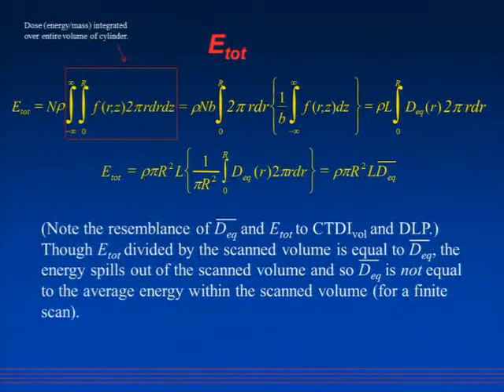What this amounts to is, if you do this uniformly and so forth, you can easily show this is equal to the length of the scan, if you were to do this in a helical fashion or an axial fashion, times DEQ bar. Notice how this looks an awful lot like DLP. In fact, this sort of justifies DLP to some extent. DLP still has a lot of issues, but this sort of puts it in a proper framework.